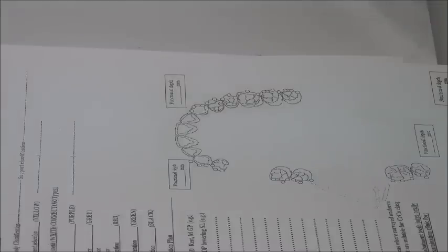What else can I change here? Can I still use the acrylic? Yes. Do I need to change the open lattice? Yes, it's better to place mesh. Okay? So, 2 things we changed from our design. The mesh for the resin retention area and the major connector, now I could put a palatal bar.